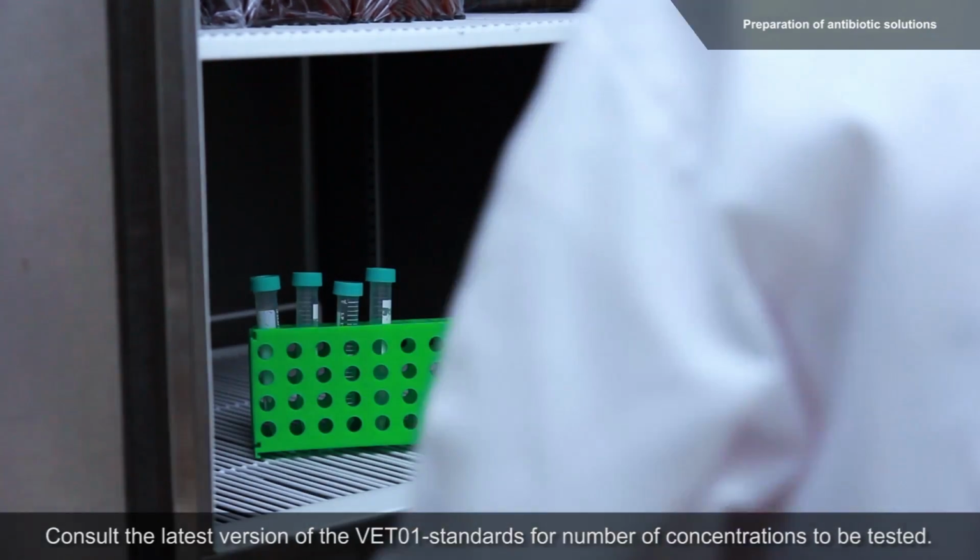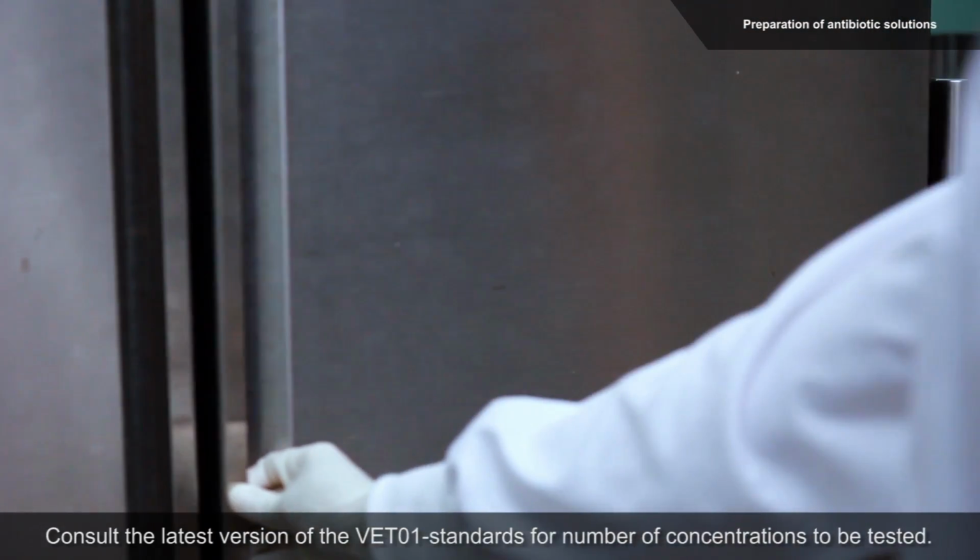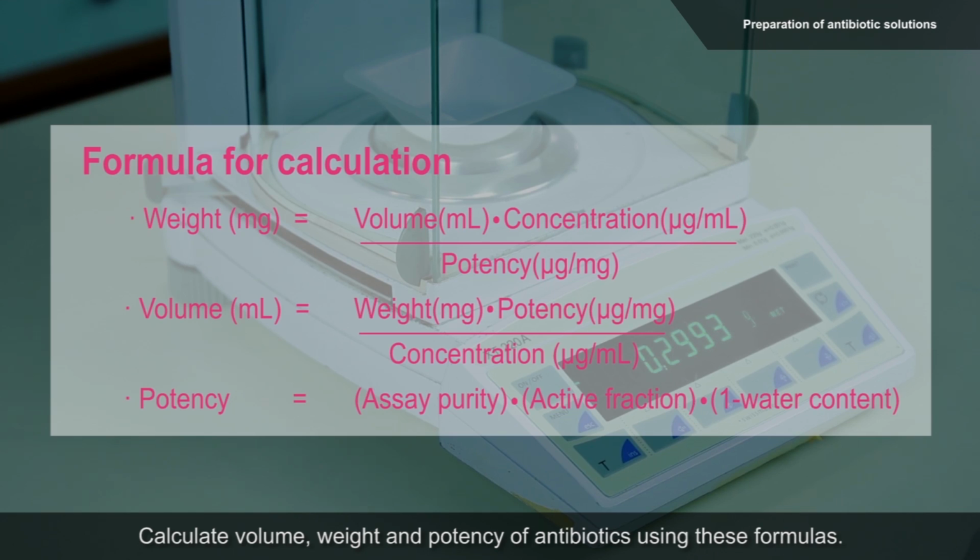Consult the latest version of the Vet01 standards for the number of concentrations to be tested. Calculate volume, weight, and potency of antibiotics using these formulas.